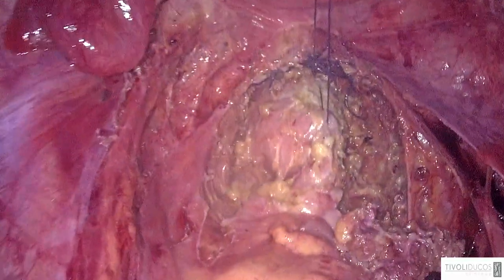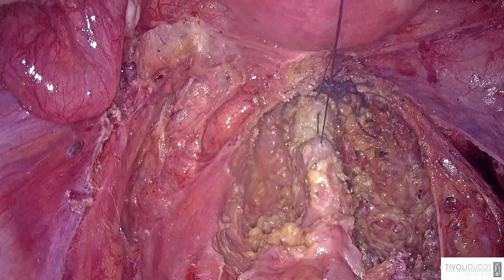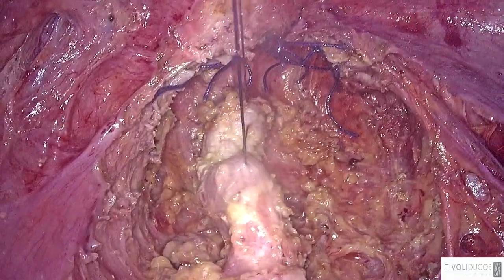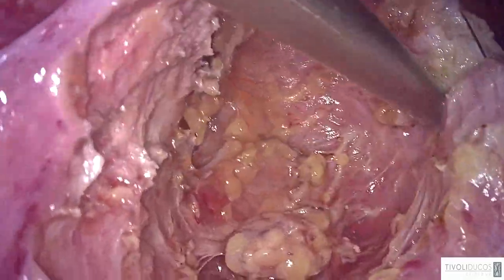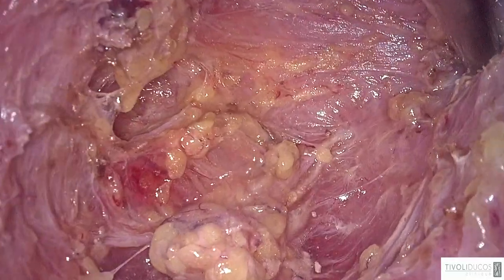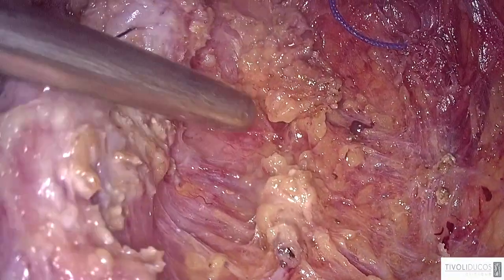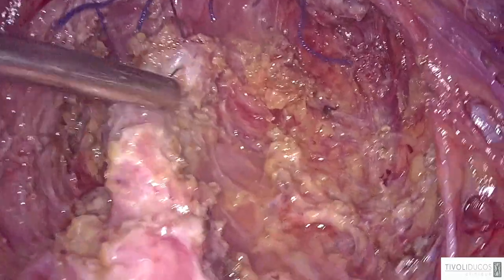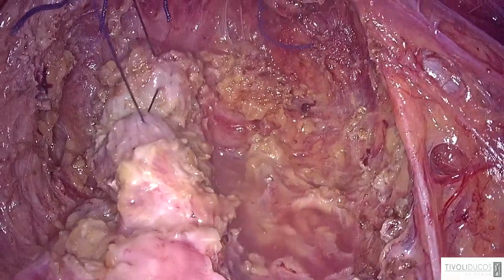Okay, very well. Now, Ahmed, you can remove completely the rectal probe. So you see, I prepared the lateral rectal wall to be stapled, so the stapler will close here. It will be far from the vessels. Here, maybe we have a vessel. I will coagulate it, because if it is caught in the stapler, it may result in rectal bleeding.